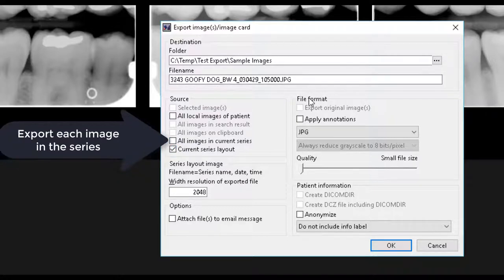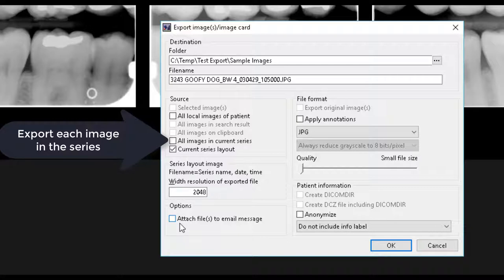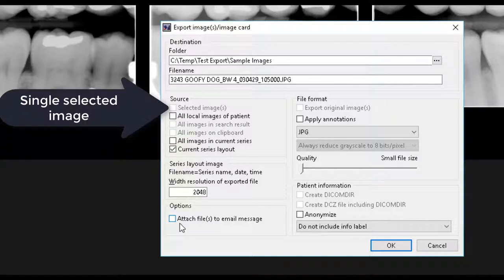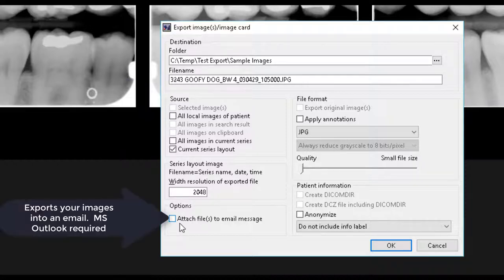All other options produce a single file for each image in the selection. If you wish to attach the exported images to an email message, you can select this action under the Options section. This will automatically open your email client and attach the exported image files directly to the email.